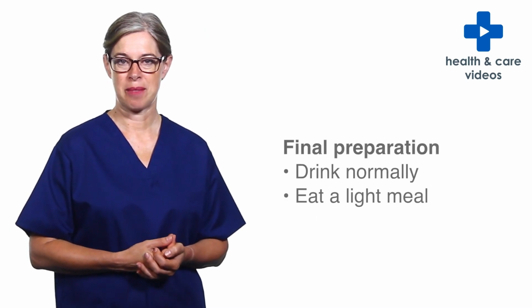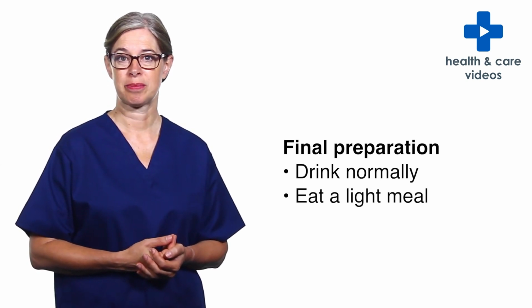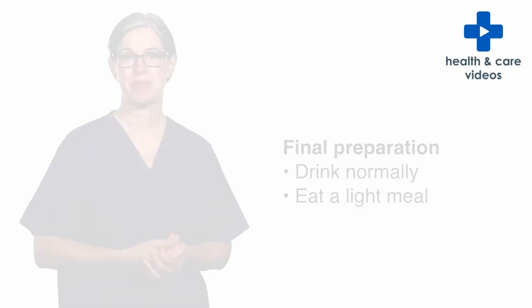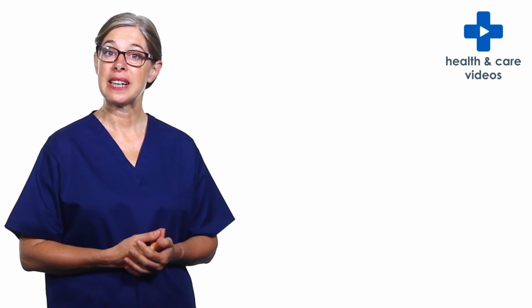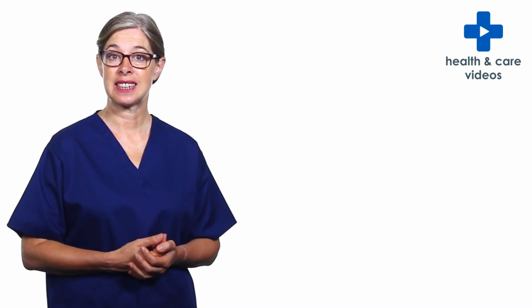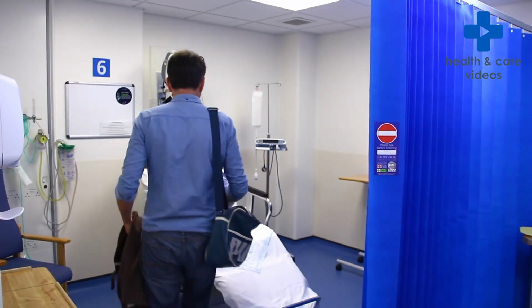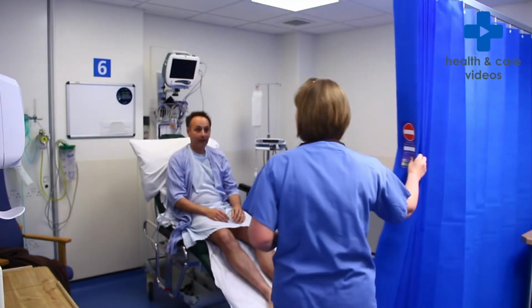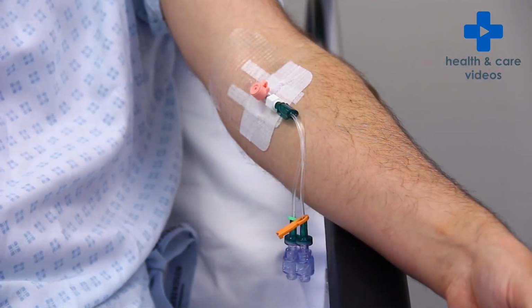On the day of your angiogram, we recommend that you drink normally and eat a light breakfast before coming into hospital. If your appointment time is at 12:30, you may also have a light lunch. Please arrive at the angiography department at the time detailed in your appointment letter and take a seat outside recovery. A nurse will welcome you into your bed space when it's available. You'll be asked to change into a gown, and one of the nurses will take your blood pressure, oxygen levels and temperature, as well as inserting a cannula into a vein, preferably in your left arm.